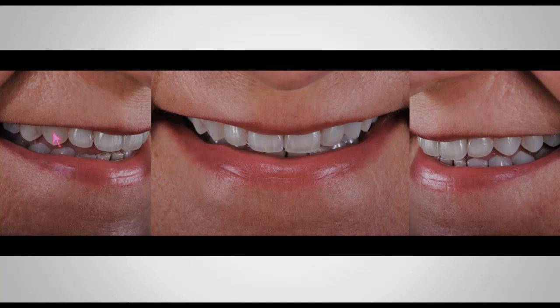And I want to show you something. This is the canine. This is the patient's natural canine. And look at the gray and the white and the little fracture lines, exactly the same things the lab tech was able to recreate. This is not me. This is the lab tech.